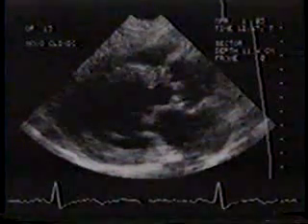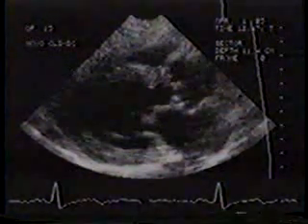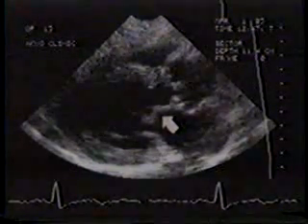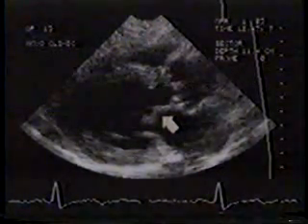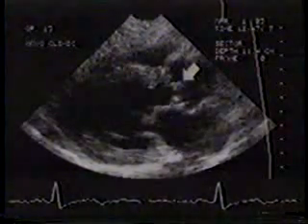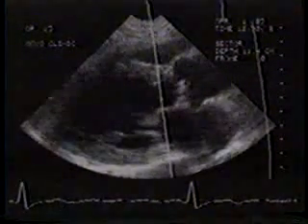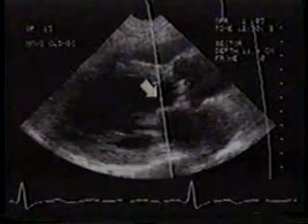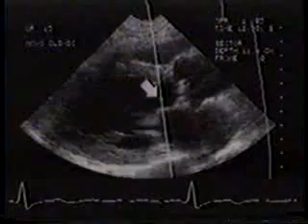This patient has rheumatic mitral and aortic valve disease. Note the hockey stick appearance of the anterior mitral leaflet. Both the mitral and aortic valves are thickened. For detection of aortic regurgitation, a pulse sample volume has been placed in the left ventricular outflow tract. This is the resultant pulse Doppler spectrum, which confirms the presence of aortic regurgitation.